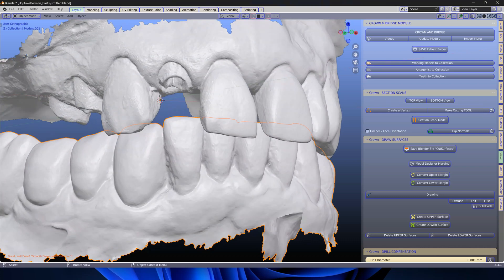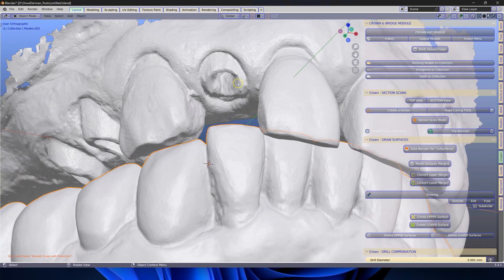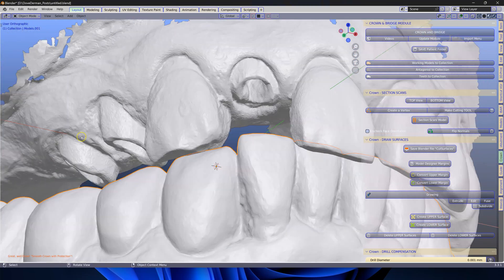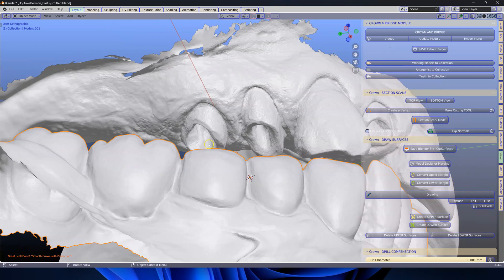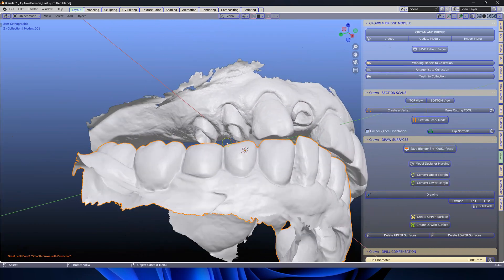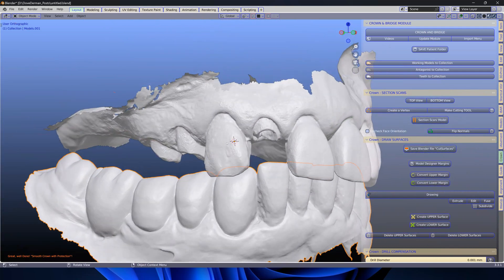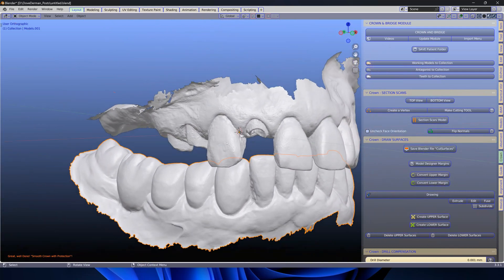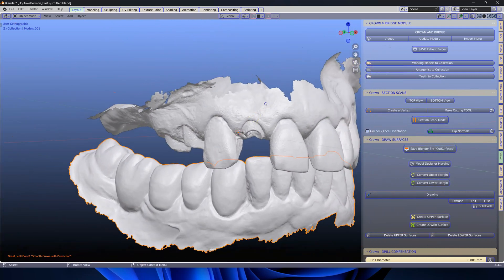Today I have been asked to make three posts and I will show you how easy it is to make it in Blender for Dental.